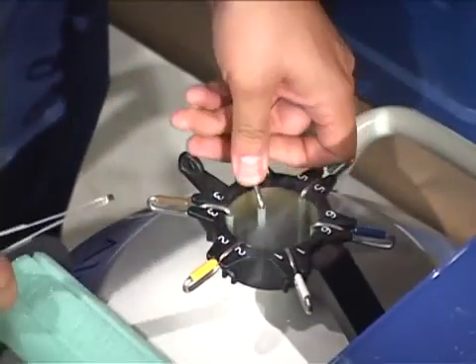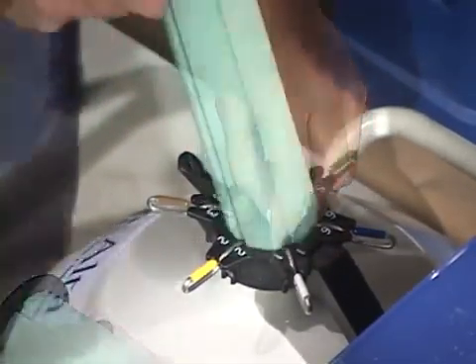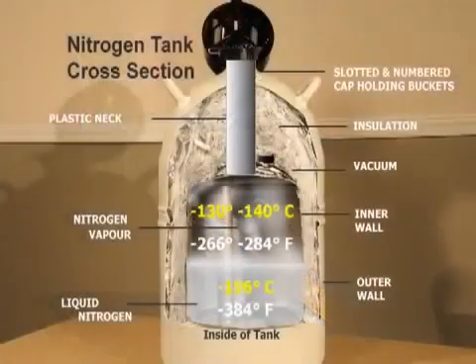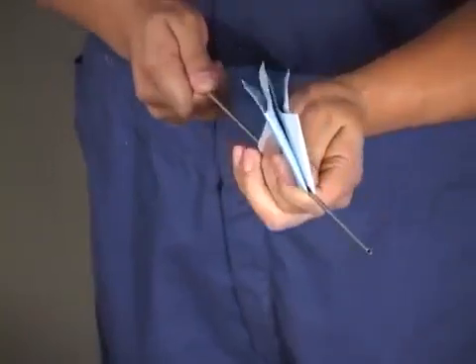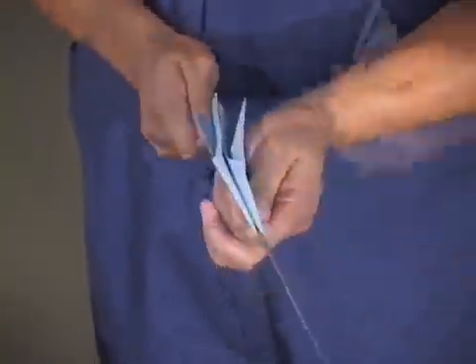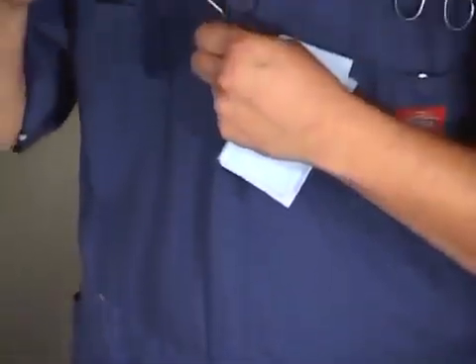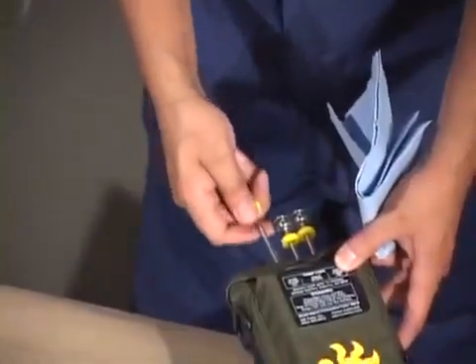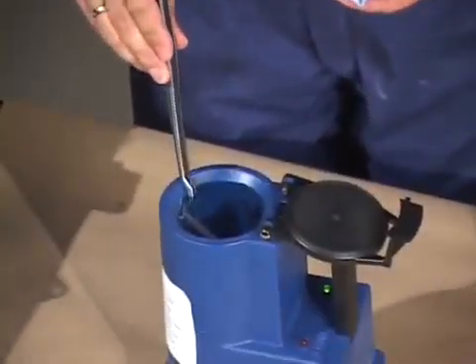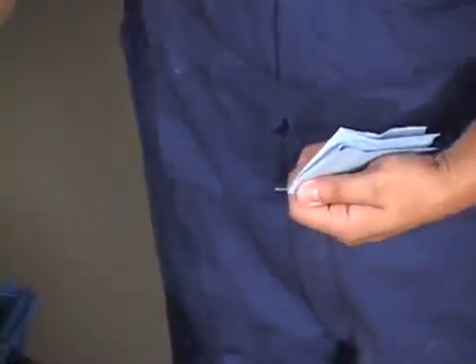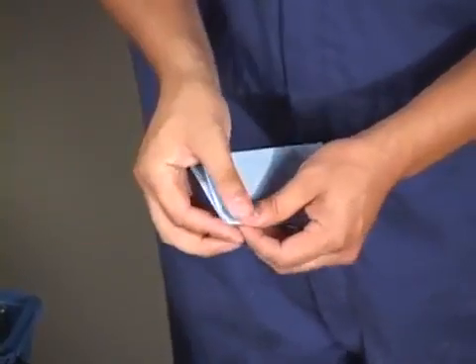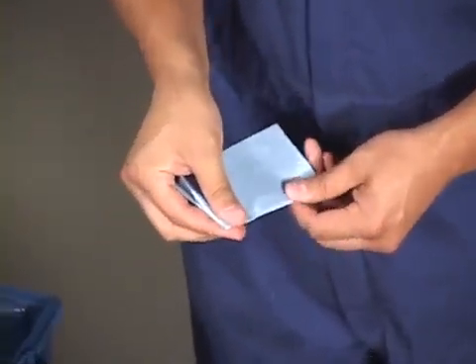Once the straw has been removed, make sure to put back the lid of the tank and close it correctly. Many breeders lose canes of semen to the bottom of the tank because they do not handle the canister correctly. While thawing the straw, pre-warm the AI gun by rubbing it with a paper towel and keeping it inside coveralls or a shirt, or place it inside the gun warmer. With the tweezers, remove the straw from the thaw box and place it into a folded paper towel — completely dry the semen straw, because water is lethal to sperm cells. Always protect semen from exposure to sunlight and from cold shock.